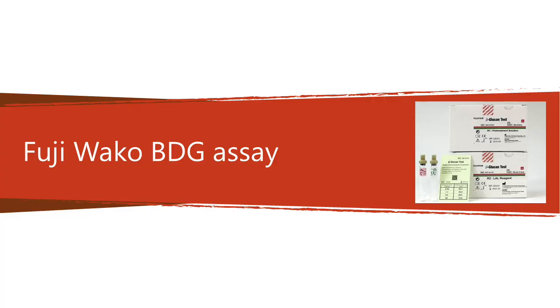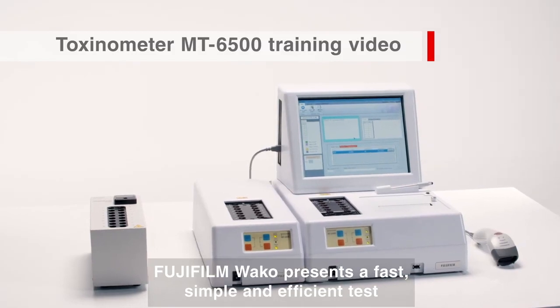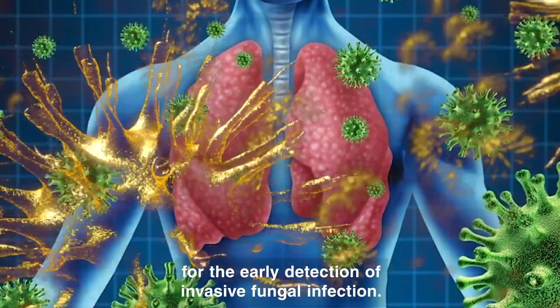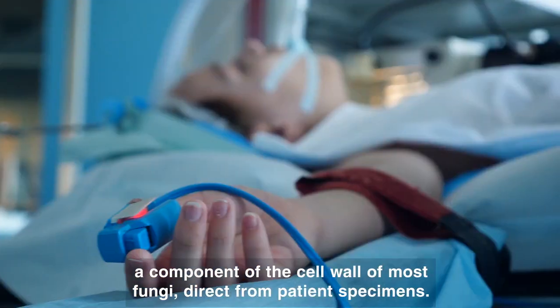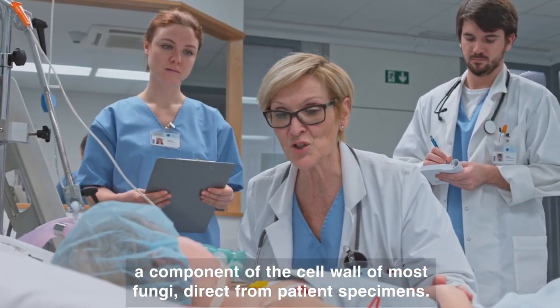The third assay we're going to show you is the Fujifilm Wako procedure. Fujifilm Wako presents a fast, simple and efficient test for the early detection of invasive fungal infection. The assay is based on a turbidimetric test, determining the levels of Beta-D-glucan, a component of the cell wall of most fungi, direct from patient specimens.